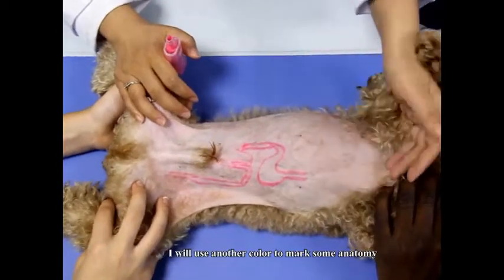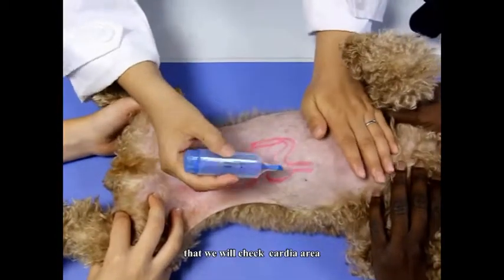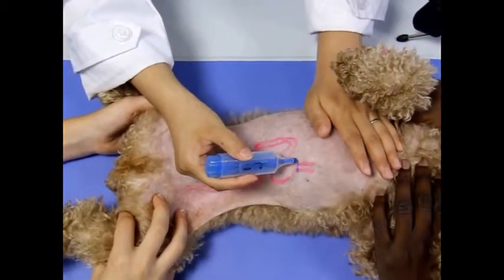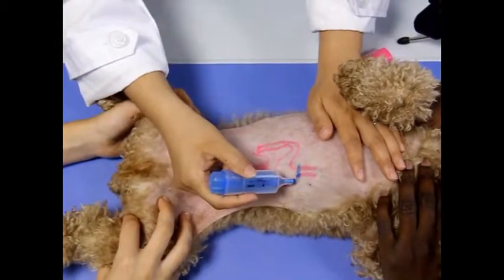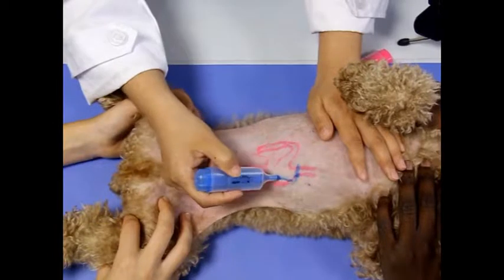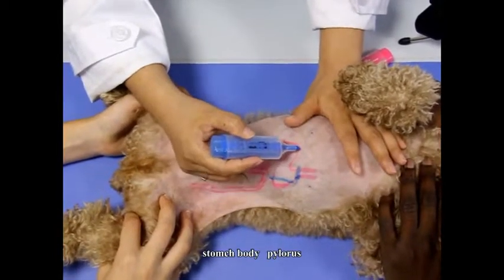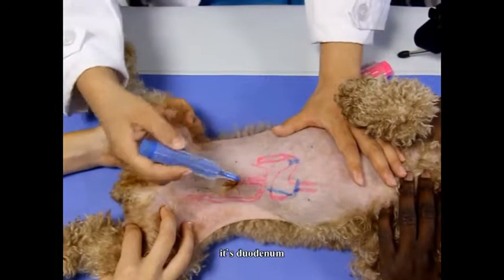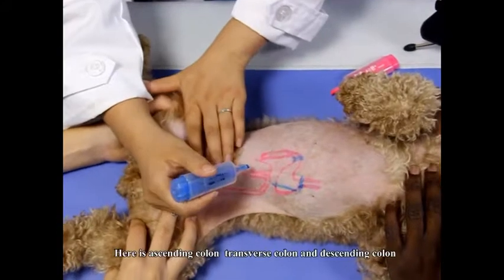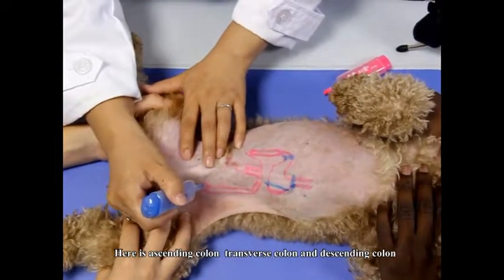I will use another color to mark some anatomy that we will check: cardiac area, fundus, stomach body, pylorus, duodenum. Here is the ascending colon, transverse colon, and descending colon.